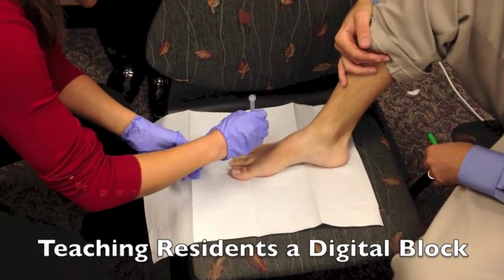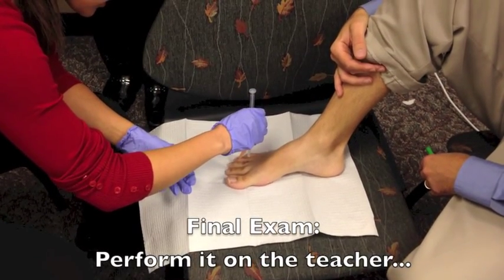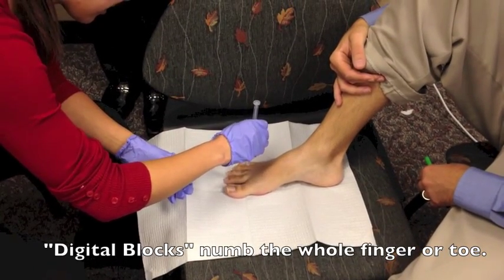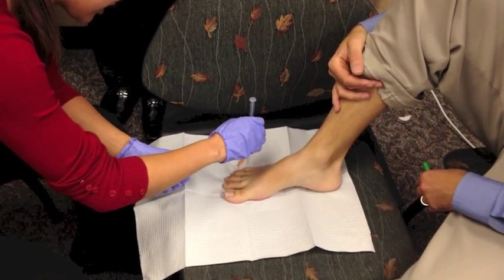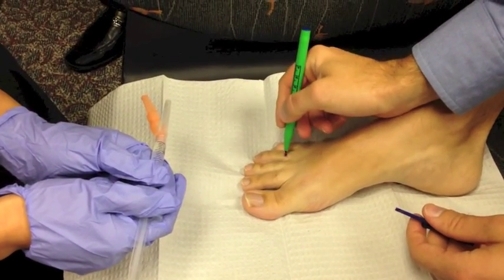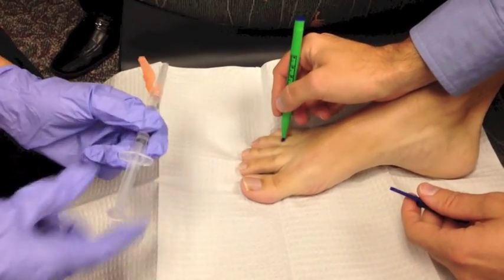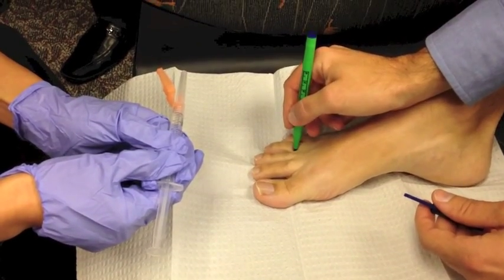I'm going to inject here first and then go straight down and aspirate to make sure I didn't hit a blood vessel, then inject on my way out. When I get to the surface I'm going to move this way and do the same thing and inject down there. The bone's right there so it's going to go just lateral — if we feel the bone we just move it lateral. If you're too close to the middle you're going to hit it, so being kind of right is better.